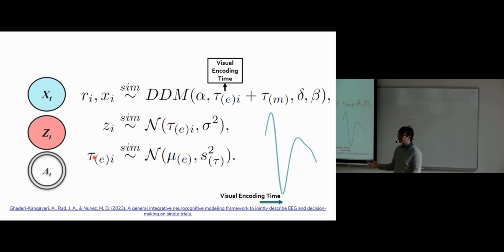But in general, it doesn't solve the problem of unidentifiability. Let's say that we put in a simulation of the entire brain and we allowed EEG to be generated by single dipoles, extended cortical activations, kind of like in my simulation, multiple dipoles, and then you're simulating to the scalp.